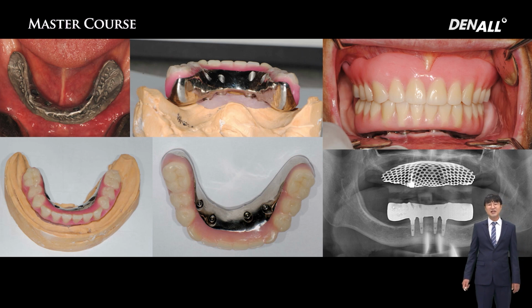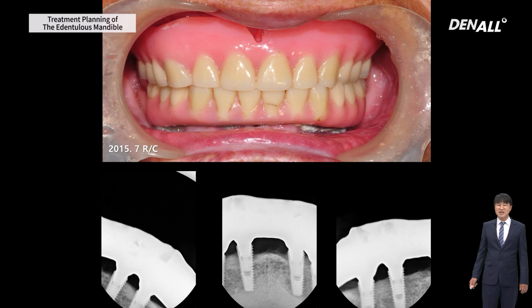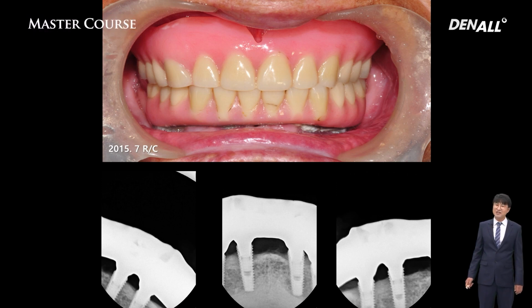This was done in 2011 with a hybrid type. I did the fixed prosthesis. I thought the patient would be happy, and I thought it was rather well done. In the short term, it looks good, but the patient was over 90 years old, and maintaining this type of prosthesis, oral hygiene was something I did not really consider. There's a high likelihood that the long-term result might be bad.